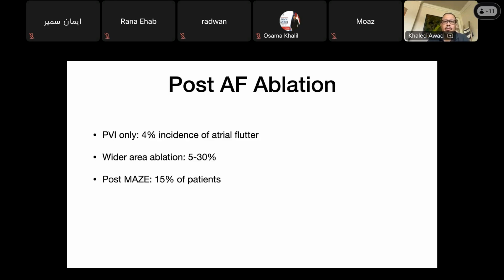Now, very important and the most relevant syndrome of all for all interventional cardiac electrophysiologists is the post-AF ablation atypical flutter. And so that is something we cause. This is man-made, doctor-made flutter. For the most part, some of it is, there was substrate. We did something in the atrium. We didn't address that substrate because it's hard to find it, hard to know what to do about it. And we get out and then they have atrial flutter down the road.